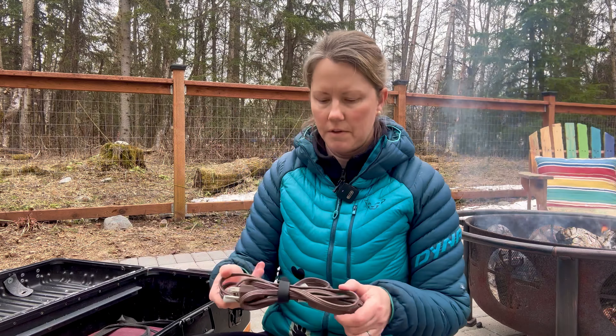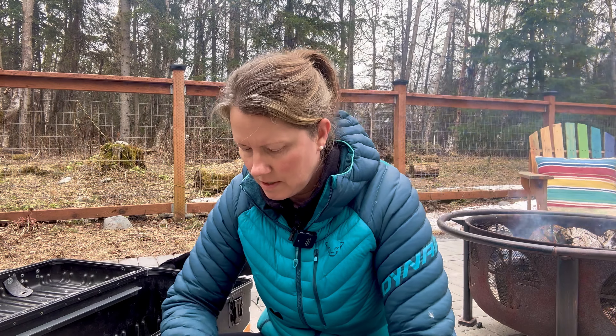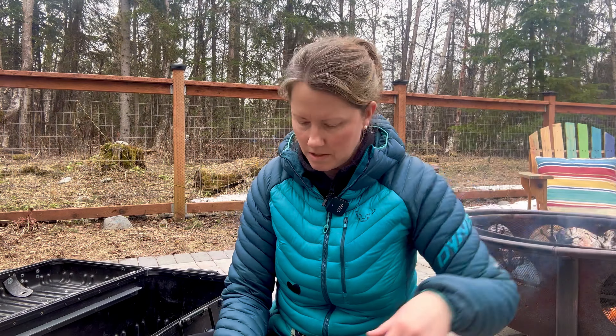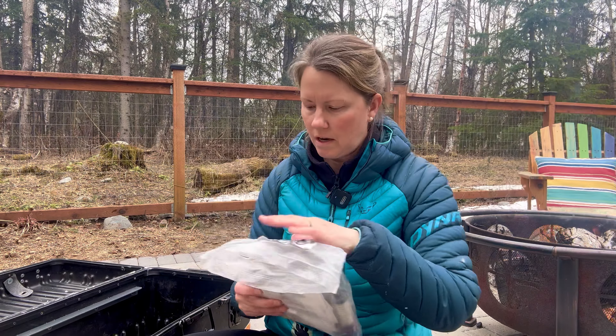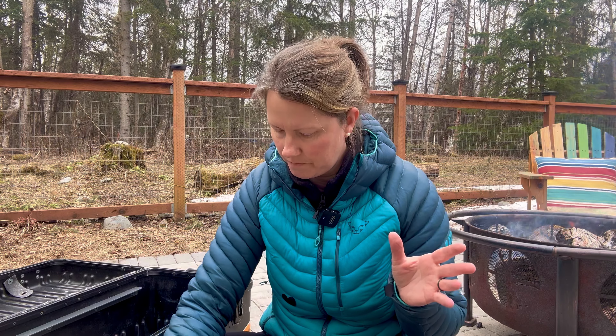I carry an extension cord because it can be difficult to find outlets in these older clinics — there aren't many, and even if one is available it might be across the room. I also carry this tool bag that holds spare parts — mostly dental parts — fairly generic stuff that the majority of villages have in common and things that tend to break.